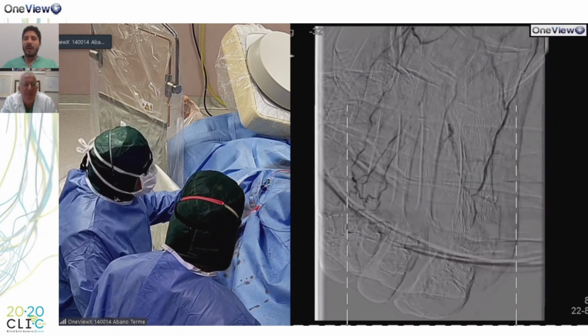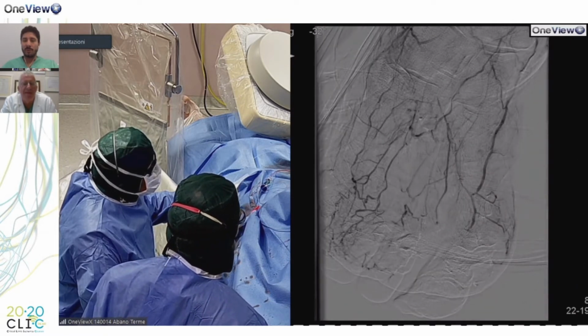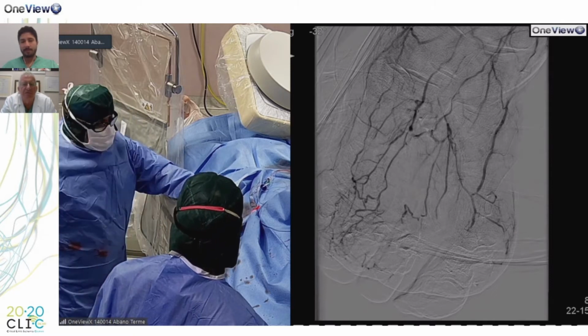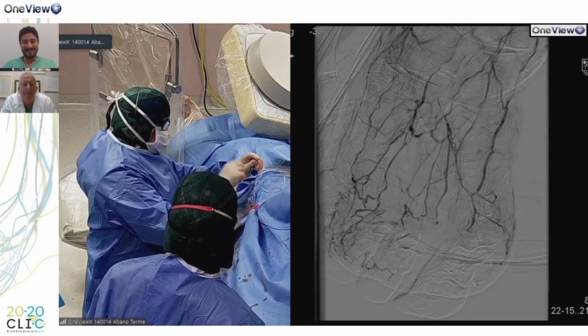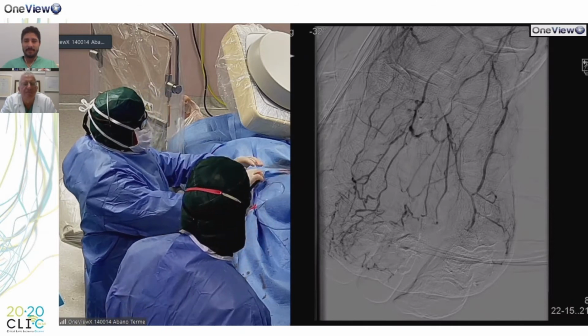Marco, can I ask you to do this check with CO2 also through the Rubicon catheter? Yes, of course. I was waiting for your suggestion. I'm ready to shift the line on the microcatheter.